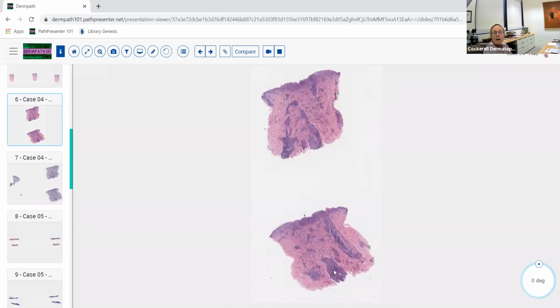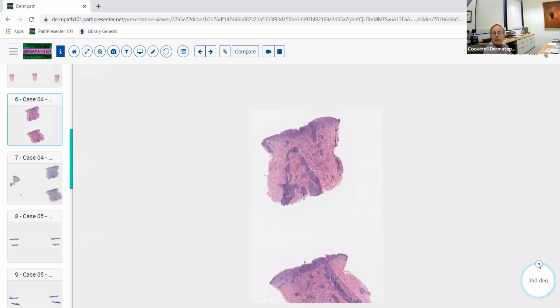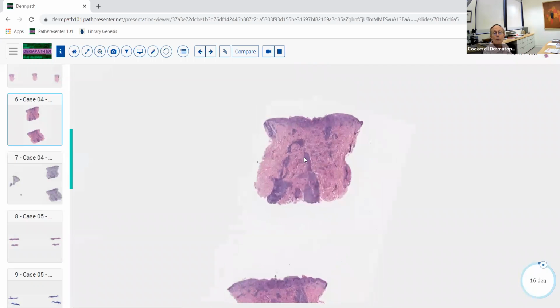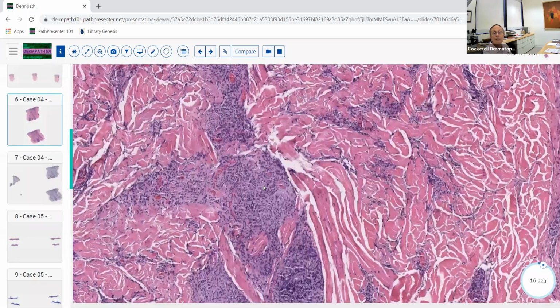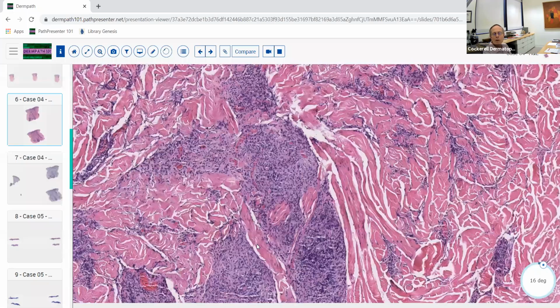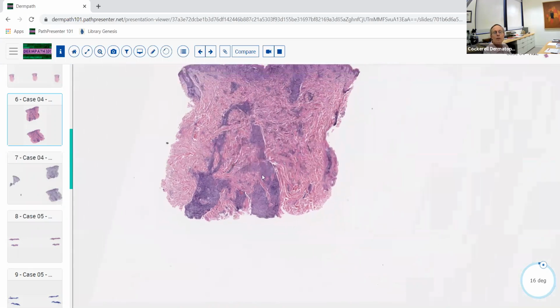Okay, another spirochetal infection, and here we've got a different pattern. We've got a superficial and deep, somewhat psoriasiform, band-like infiltrate, and even at low magnification, you say, wow, those cells are definitely not lymphocytes here. A lot of these, in this case, are histiocytes and also plasma cells. And notice that the histiocytes are forming granulomas, but they're not forming tight epithelioid granulomas like we see with sarcoidosis. It's not a palisaded granulomatous inflammatory infiltrate, so that's not really like a GA.